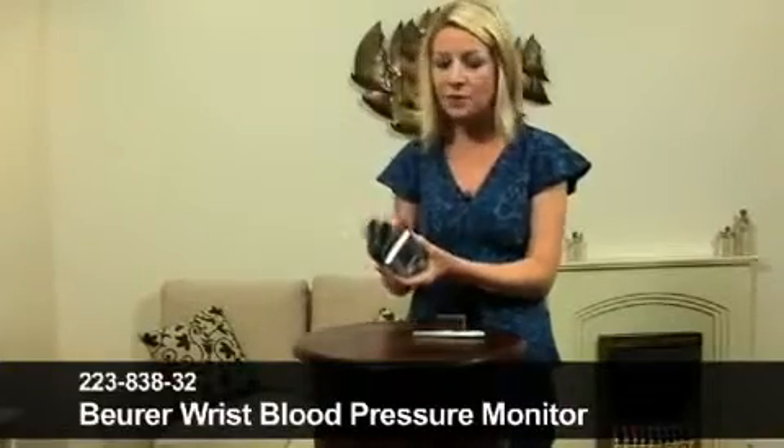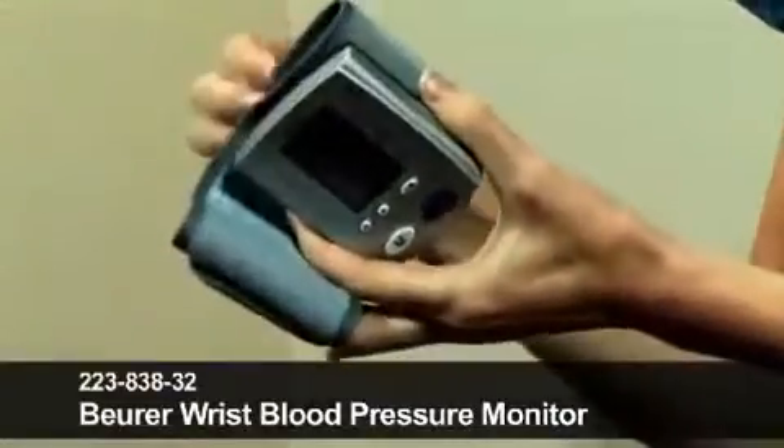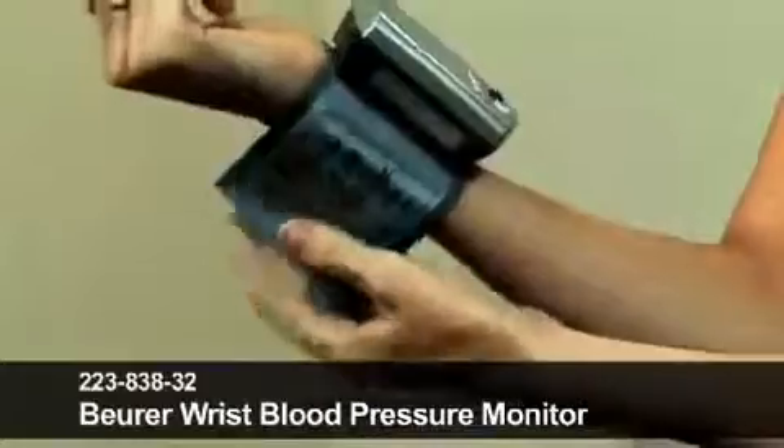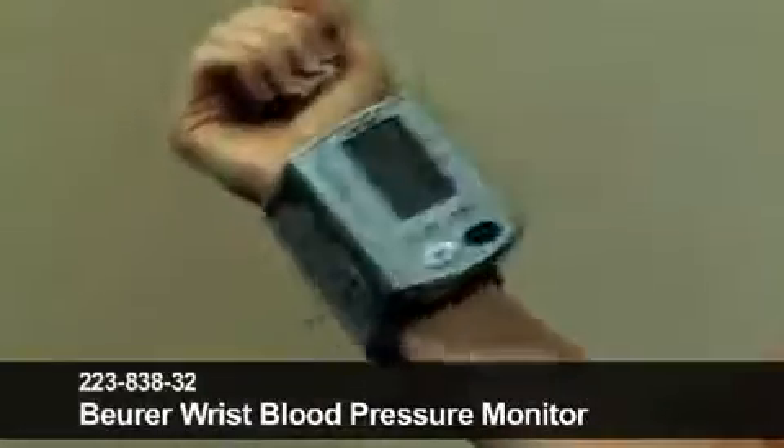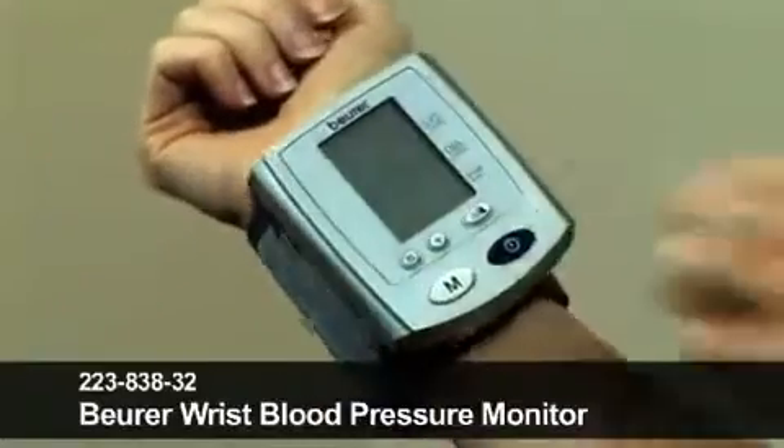Very, very easy to use. It comes with the one-touch fastening, so I'm just going to undo that, slide it onto my wrist like so, and fasten it. You can see there it's firmly attached to my wrist with that one-touch fastening.